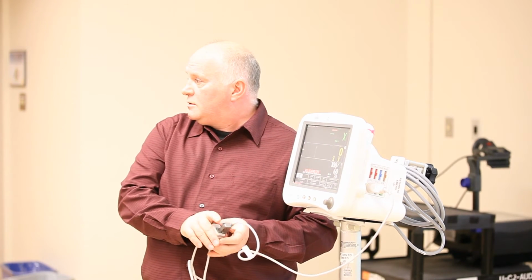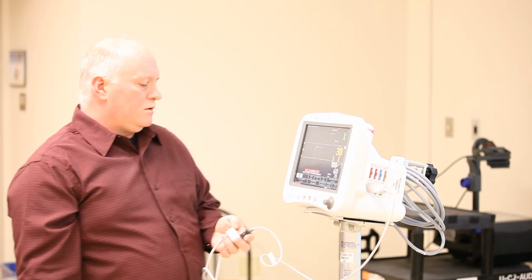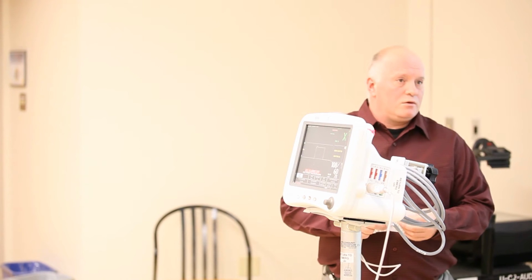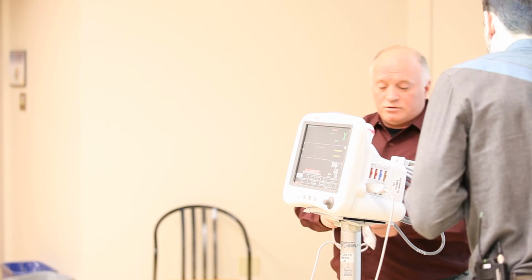If they come in with the paramedics, their monitors are capable, although they don't always use it, and he asks them to keep their monitors on until we're connected here, just as a practical point.